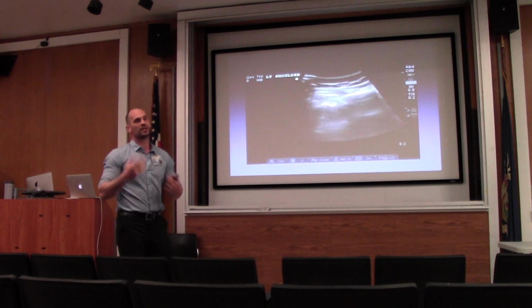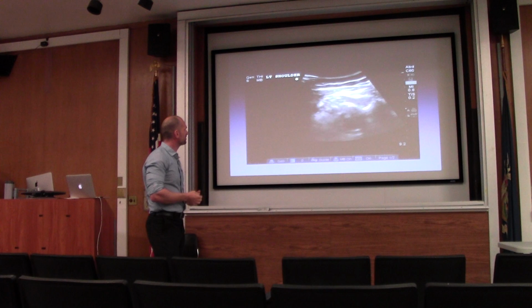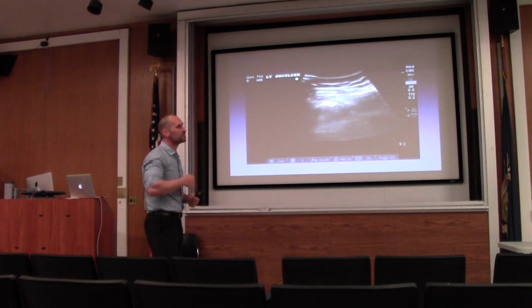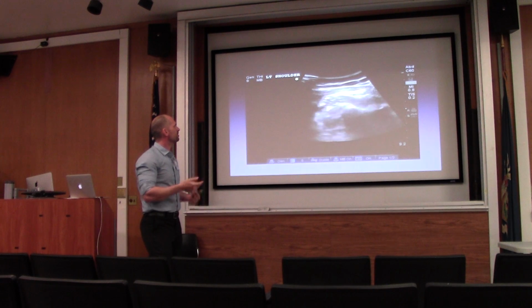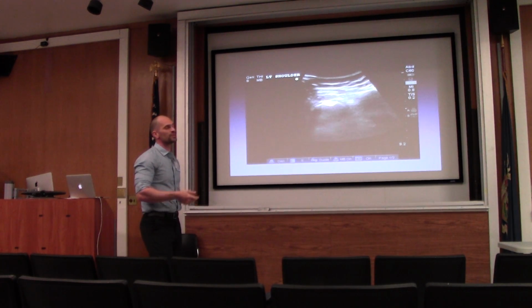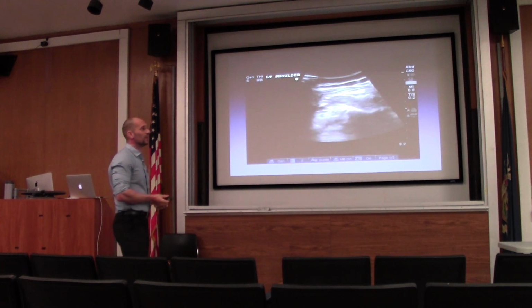One of the things that we used to do back in the day, I guess the mid to late 2000s, is we sent all these guys back and forth to x-ray over and over again. What you can do is get in the habit of using the ultrasound to assess the adequacy of your reduction. You can do this with fractures too.